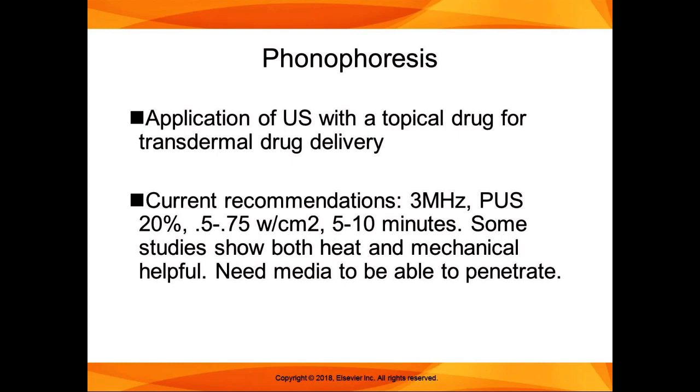So the current recommendations for phonophoresis in terms of settings are 3 megahertz, so that's our more shallow, higher frequency application. Pulsed ultrasound at a 20% duty cycle. Pretty low intensities, 0.5 to 0.75 watts per centimeter squared for 5 to 10 minutes. Some of the studies show both heat and mechanical effects of ultrasound to be helpful, but you need the media, which is usually the topical drug that comes in a cream. You need that to be able to penetrate the skin.